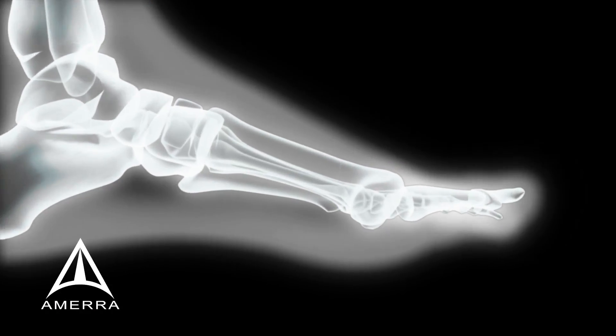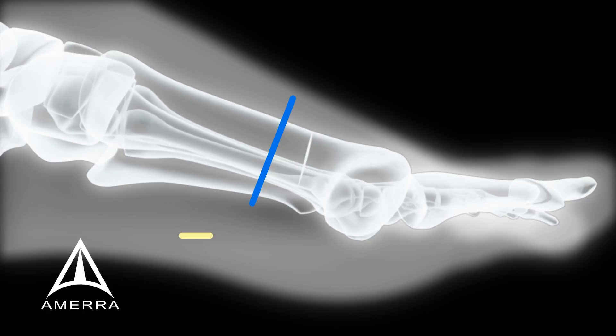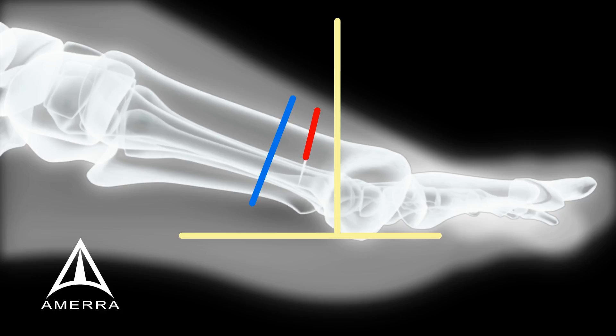Here, the blue line is perpendicular to the long axis of the metatarsal and the yellow lines are perpendicular to the weight-bearing surface. The red line splits the difference and is the orientation of the osteotomy.